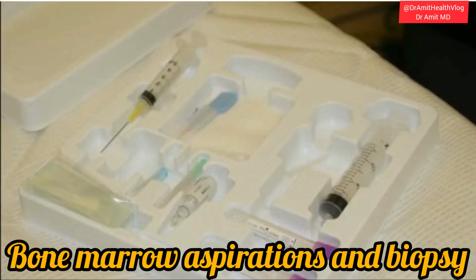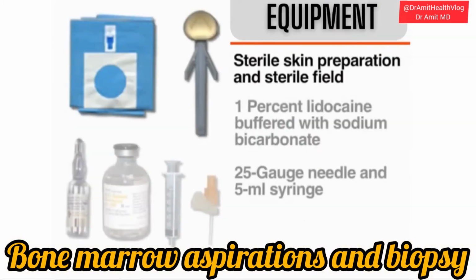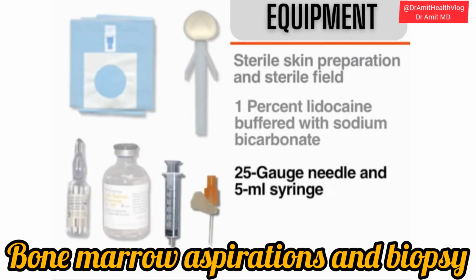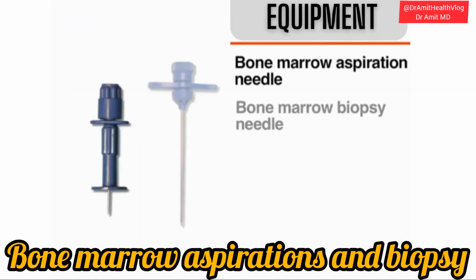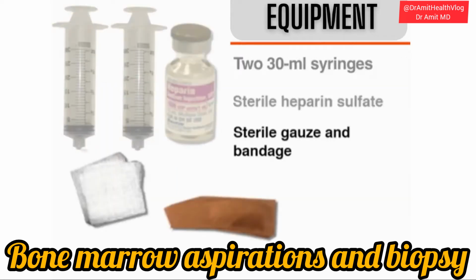Gather the necessary equipment prior to performing the procedure. You will require equipment for sterile skin preparation and a sterile field, 1% lidocaine buffered with sterile sodium bicarbonate, a 25-gauge needle and 5-milliliter syringe, a bone marrow aspiration needle, a bone marrow biopsy needle, 2 30-milliliter syringes, sterile heparin sulfate, sterile gauze, and bandage.